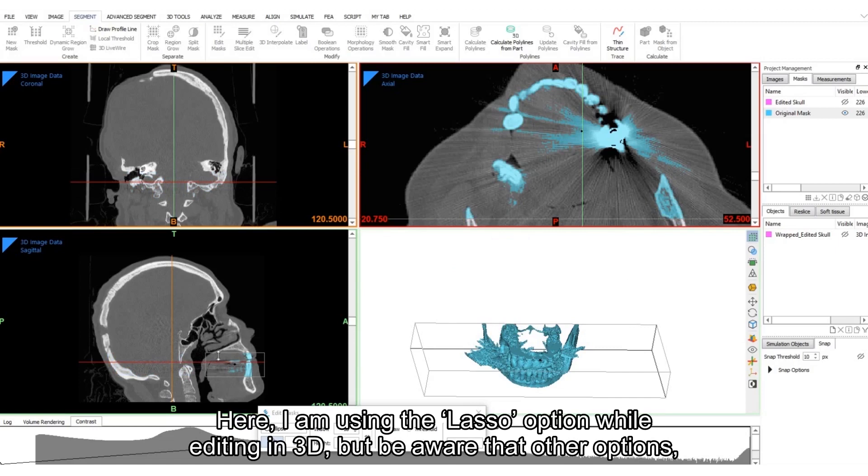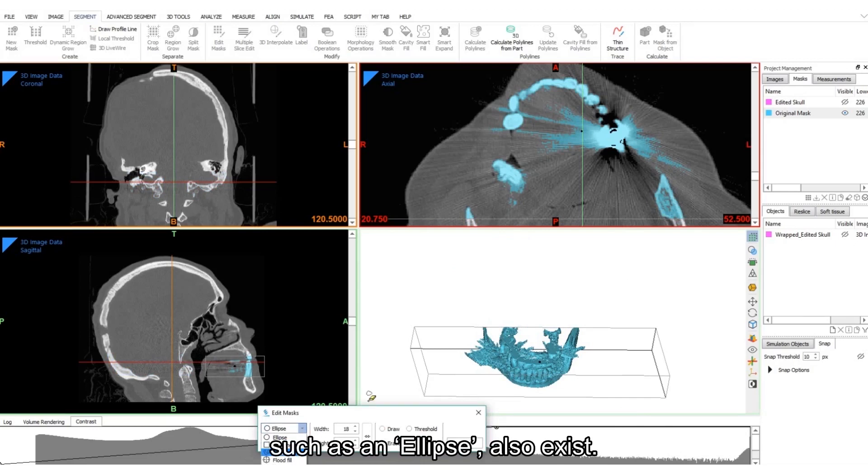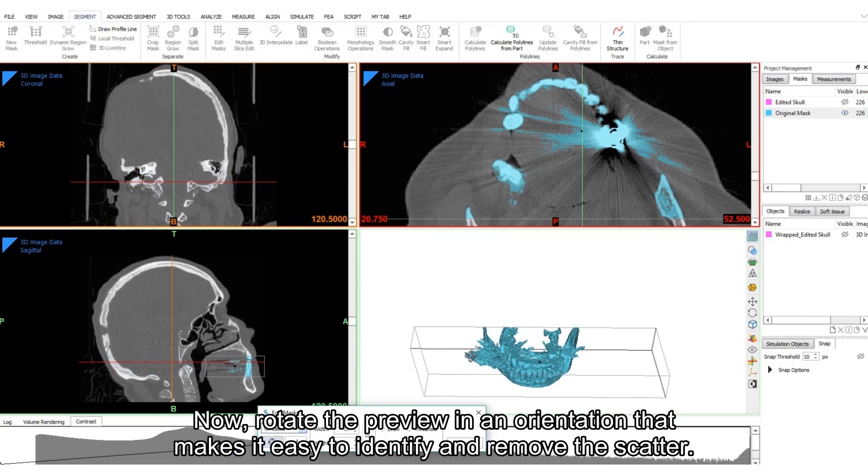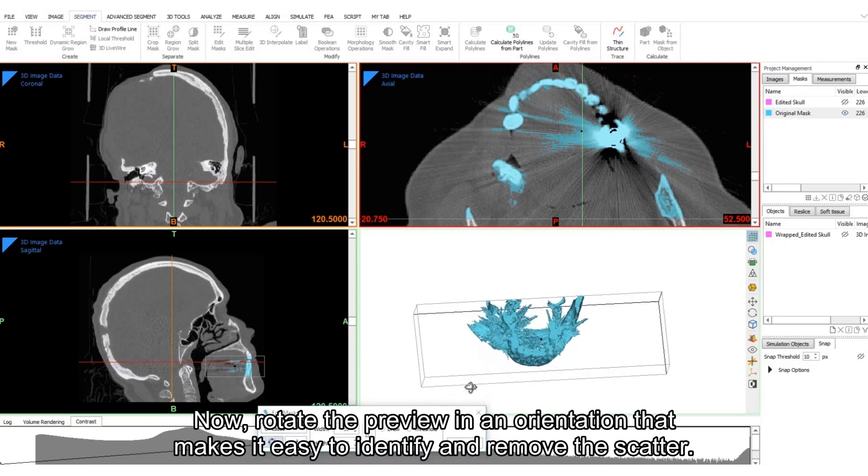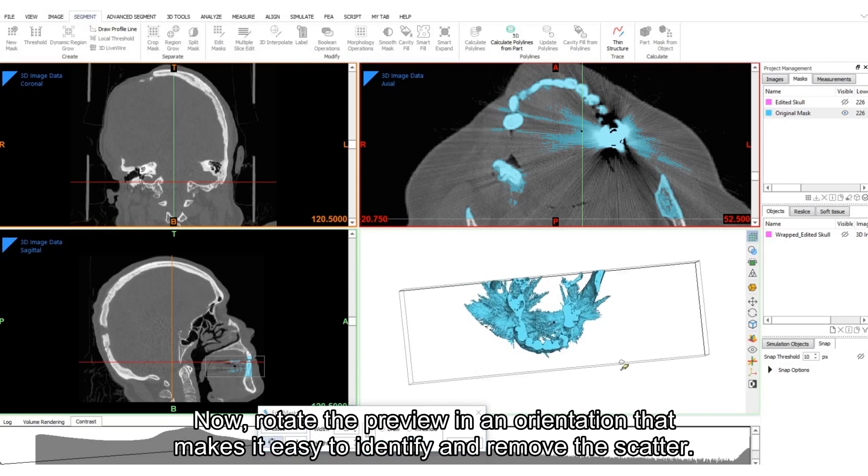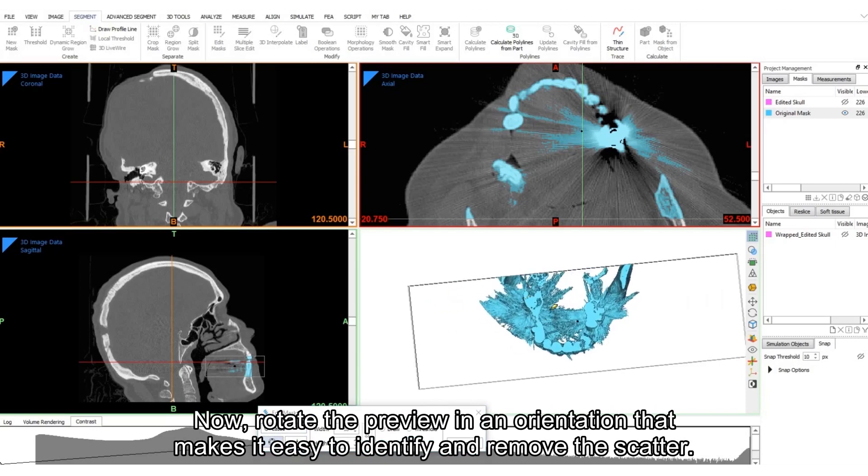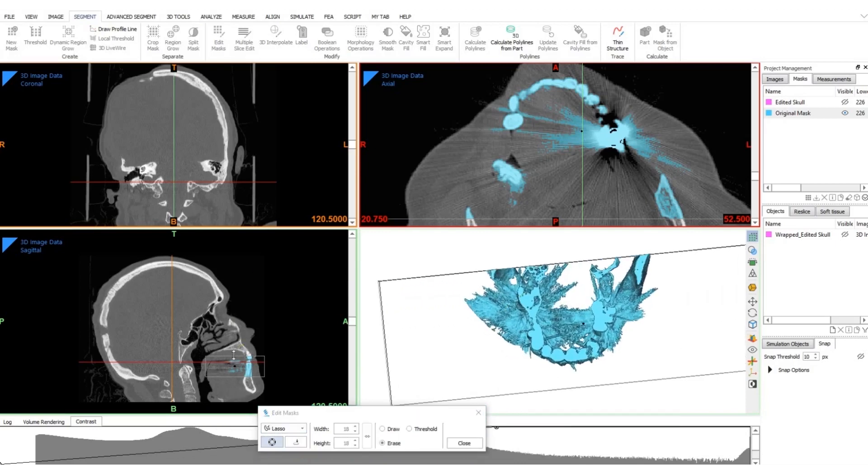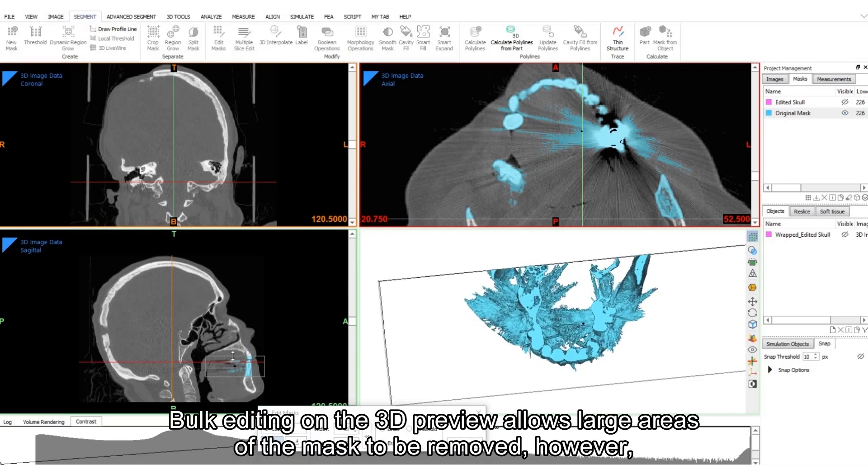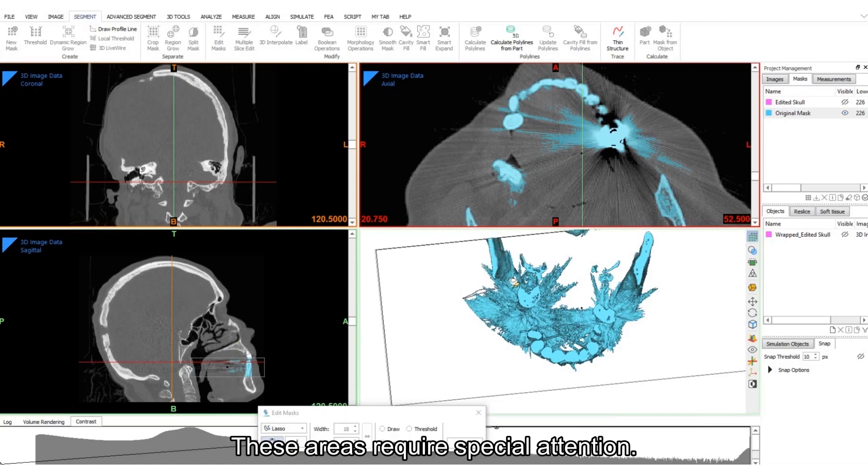Here, I am using the Lasso option while editing in 3D, but be aware that other options, such as Ellipse, also exist. Now, rotate the preview in an orientation that makes it easy to identify and remove the scatter. Bulk editing on the 3D preview allows large areas of the mask to be removed. However, it is still difficult to remove scatter that is right near the teeth. These areas require special attention.